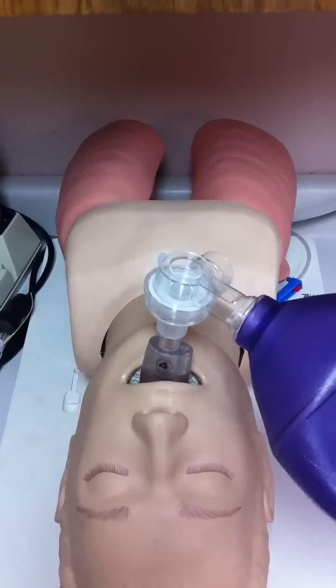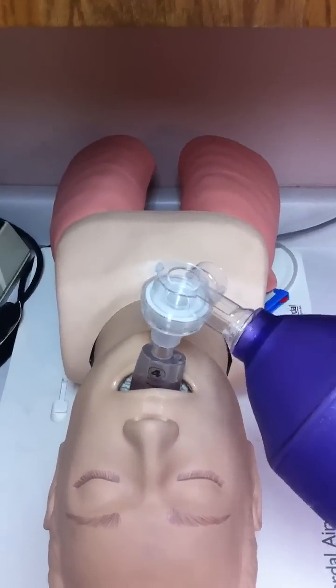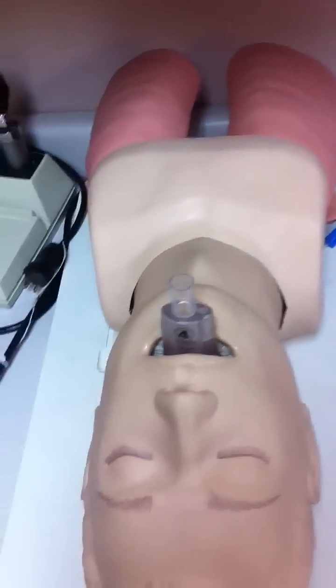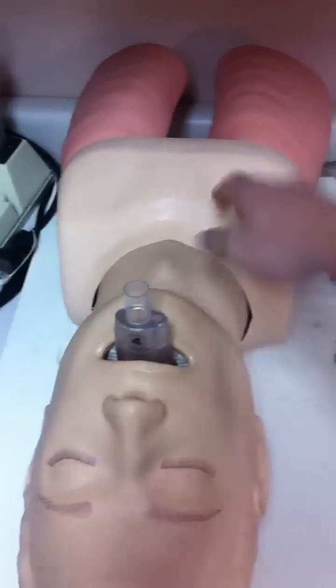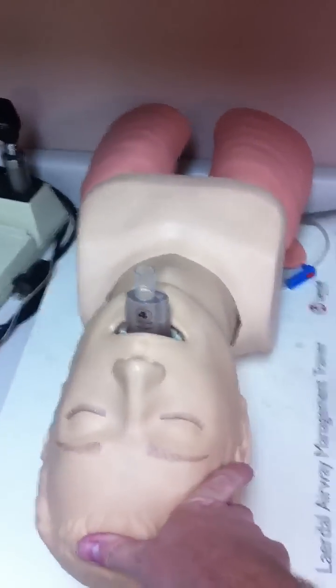You then simply attach a bag valve device and capnography and begin ventilating the patient. As you can see, there is bilateral chest rise and fall, and that airway was inserted very rapidly, very easily, very quickly. You can also go ahead and insert your gastric tube to decompress the stomach as well. So that's one of the newer supraglottic airway devices.